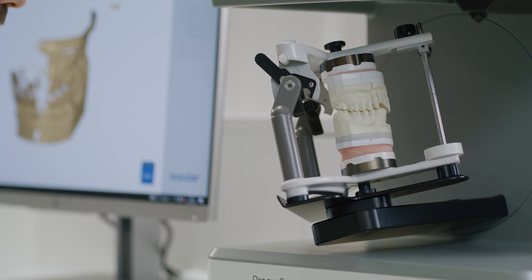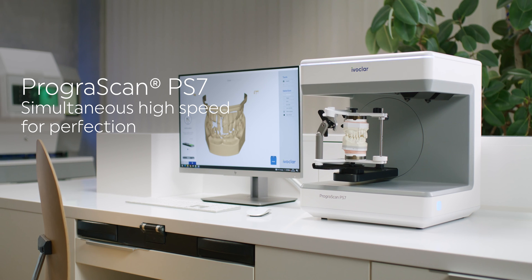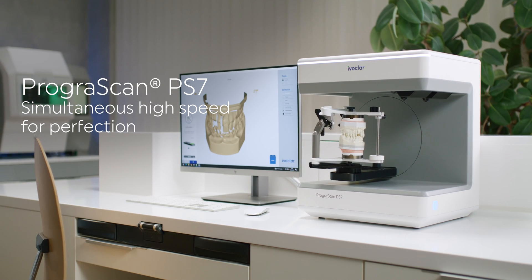The new Prograscan PS7 speeds up your daily lab routine. Therefore, it's the solution for increased production volumes.